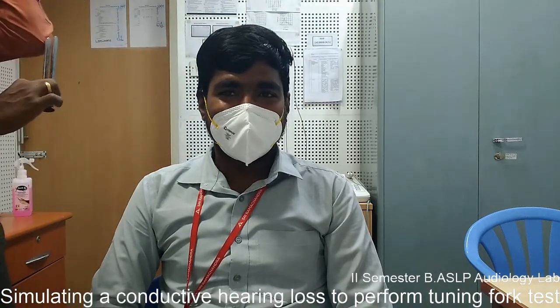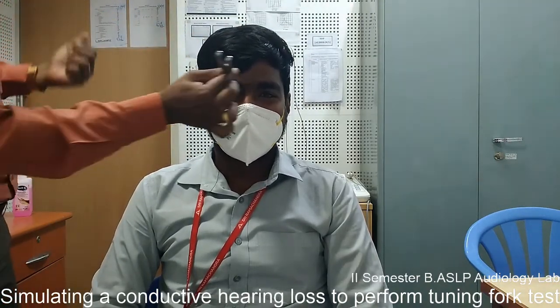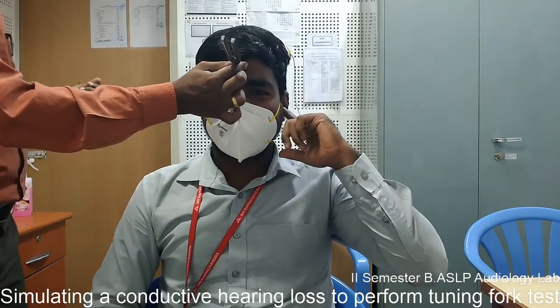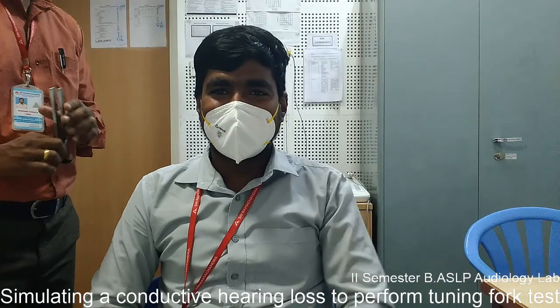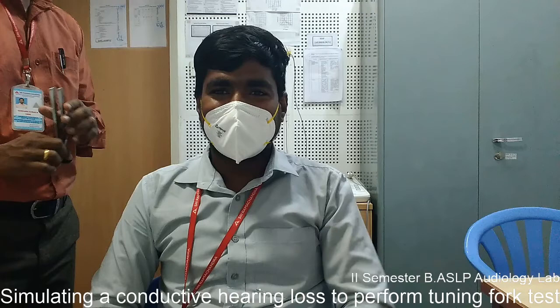The next procedure is the Weber test. The tuning fork is struck and kept in the midline. The sound is lateralized to the poorer side where air conduction was less perceived. Air conduction was perceived much better on the right side.